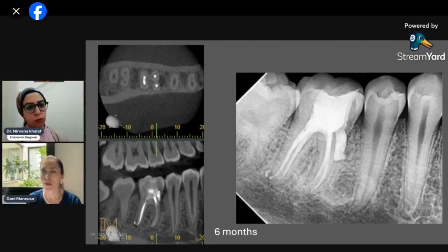In the first attempt, although it looked all right, I was not that pleased. But I said, well, let's give it time, and he's a young patient. Let's wait. It didn't heal. We opened up again, and we did just this tunnel again, not the root filling, because everything had healed or was healing nicely, so we didn't have to touch it. We didn't even remove the composite that was covering the canal, so we didn't have any recontamination.